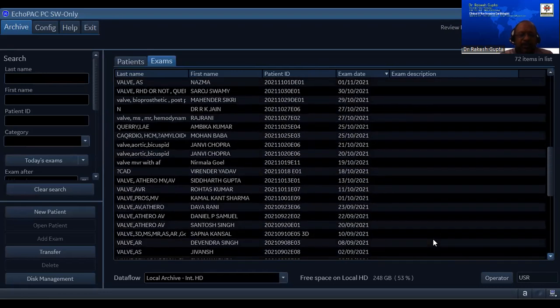So let's move on to mitral regurgitation. Look, these are tips and tricks of your day-to-day practice.